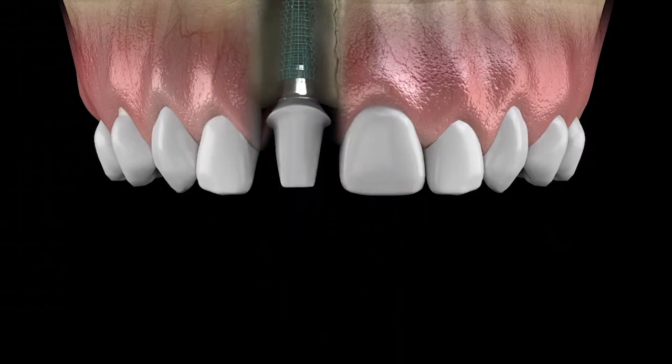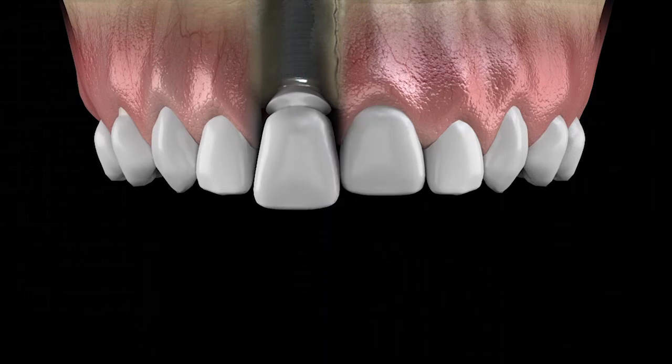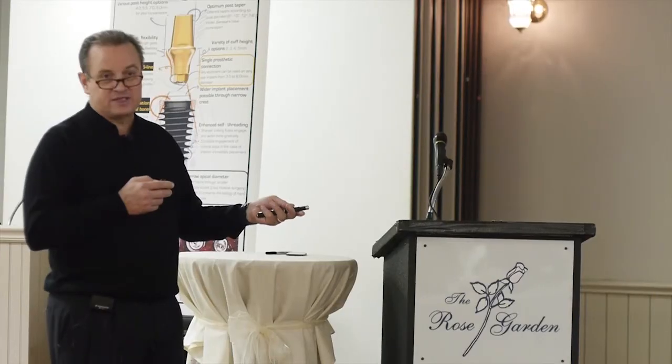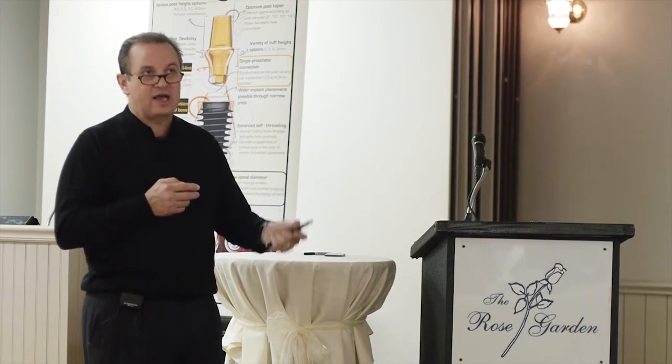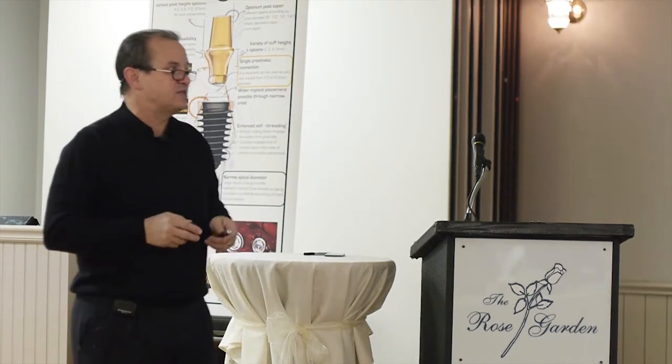And as I said before, I'll also have the lab make a custom abutment and a nice lab-processed provisional restoration to go on that same day. Instead of taking out a stock abutment and grinding on it, with part of the margin supragingival and a bunch of it subgingival, it just doesn't work as well. It's kind of the same thing on the bottom.